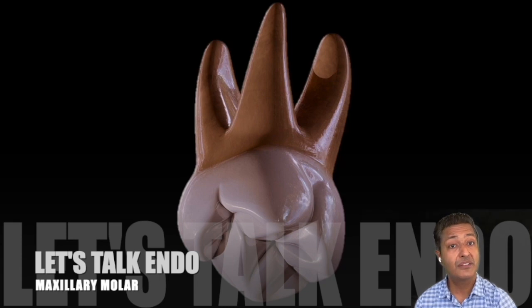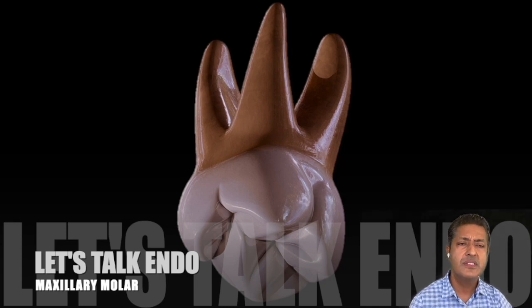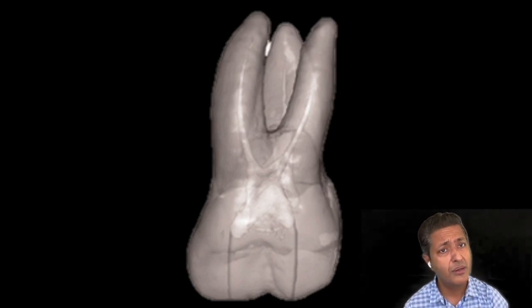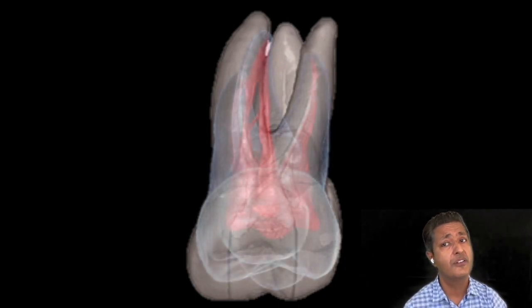Today we'll be discussing performing an endodontic access cavity in a maxillary molar. Before we start performing an endodontic access cavity, let's learn some basics about the internal morphology of a maxillary molar.